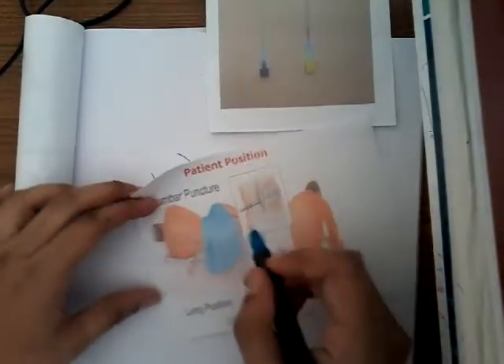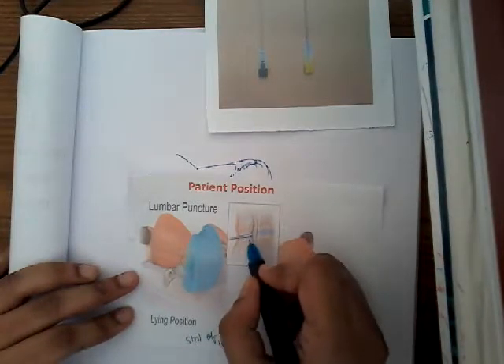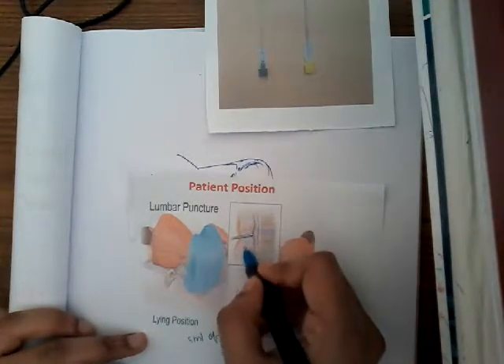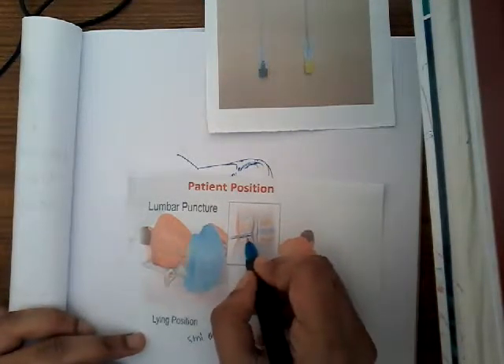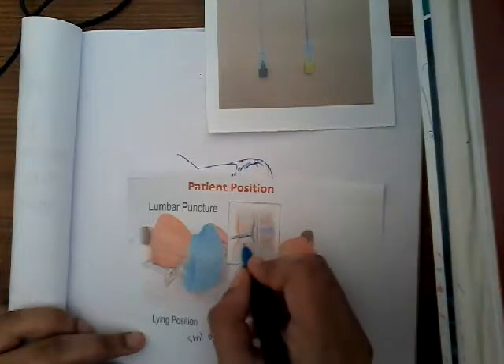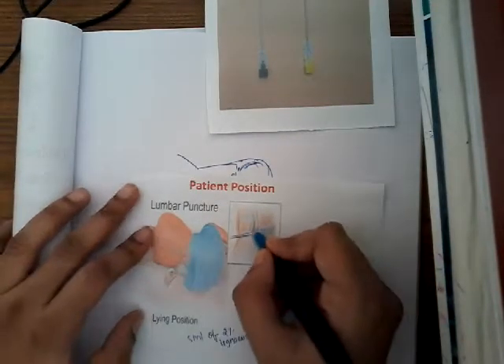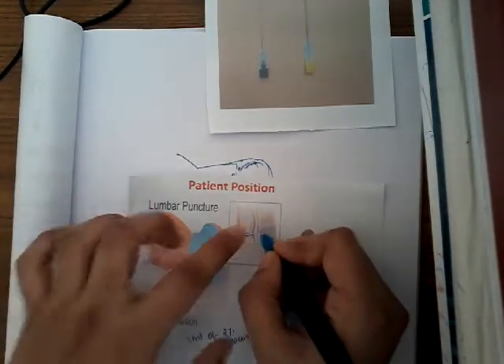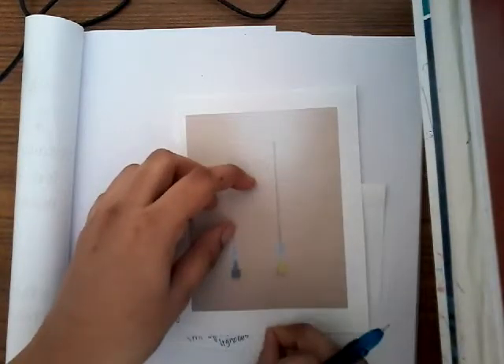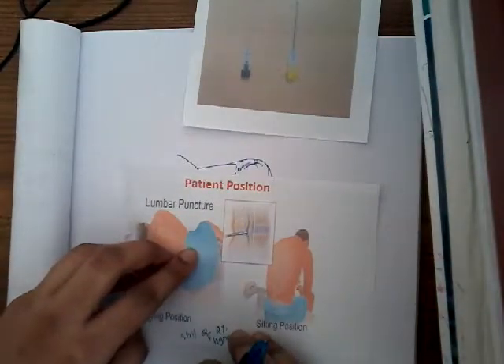While piercing, you will first encounter resistance — this is due to the spinal ligament between the two vertebrae, and also due to the dura mater. Once you have pierced through the dura mater, the resistance is gone — there is a feeling of giving away. Then you remove the stylet. Because the needle is hollow, cerebrospinal fluid will come out through it.